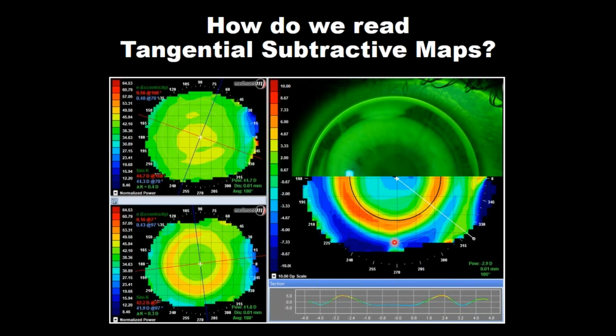Now, when we overlay our fluorescein pattern, the red, orange, yellow area is created by this reservoir of fluid, similarly to the axial map. We also see a very defined blue zone, which is where the alignment of your rigid contact lens comes down and touches the surface, where the landing zone angle is in touch with the peripheral epithelium.